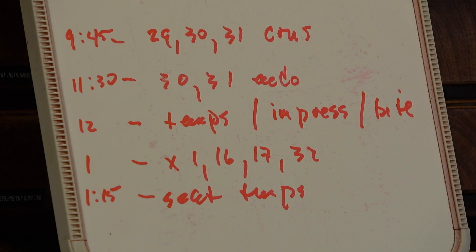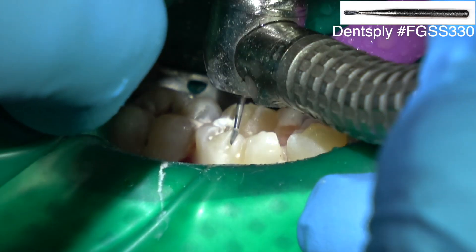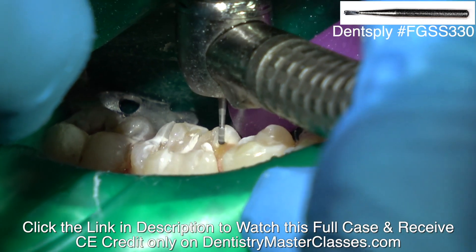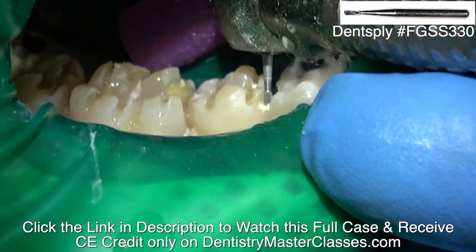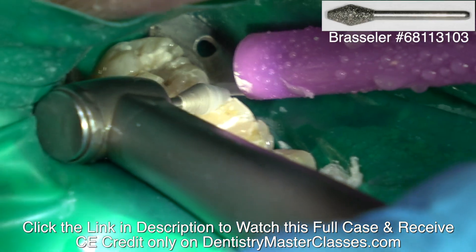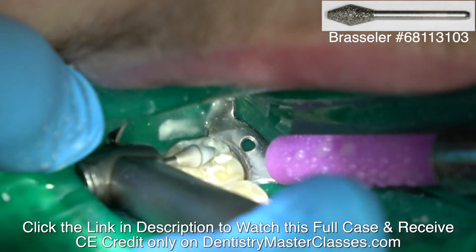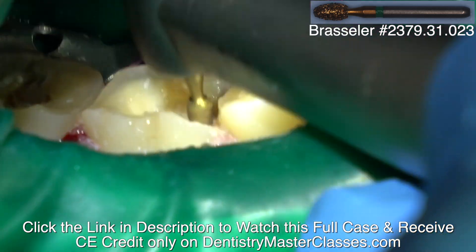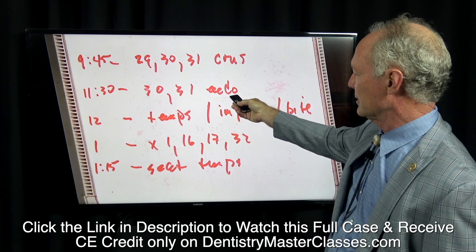This is what I did at the first appointment. I prepped three teeth for crowns and performed endodontics on the first and second molars.